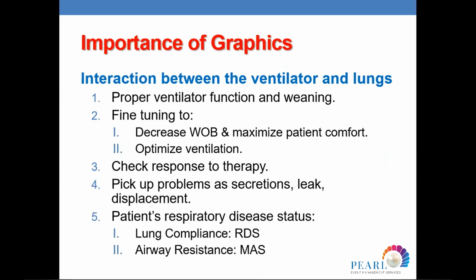So my outline for this lecture is I'll go first through some basics about neonatal ventilation, which we already discussed during the workshop, but I'll just touch on it as an introduction to my lecture. Then I'll go through the graphics, the waves and loops, how they look. Then I will go to the interaction between the patient and the machine. So, starting with the importance of the graphics.